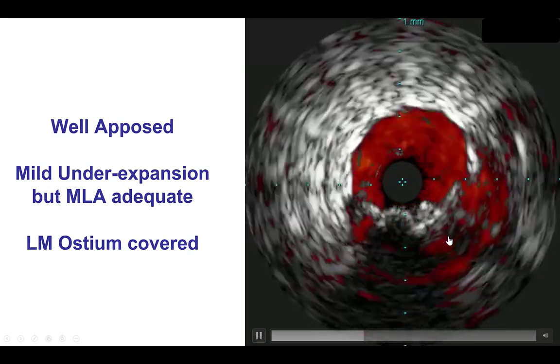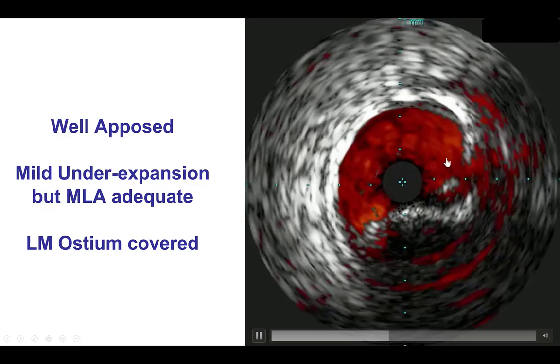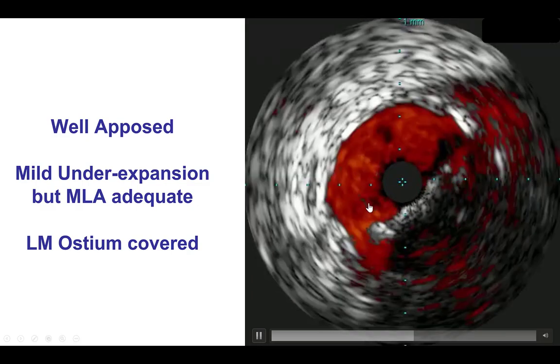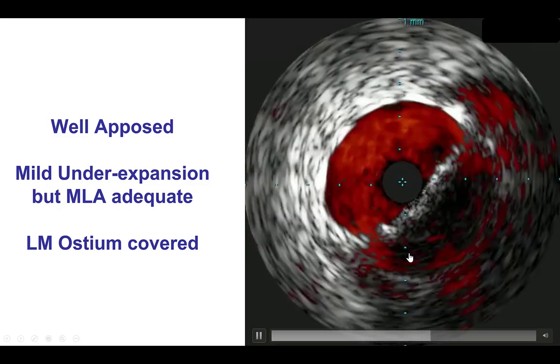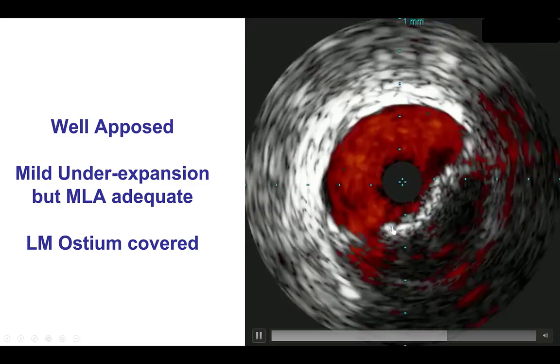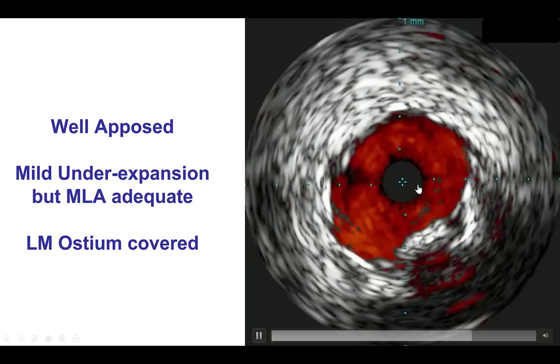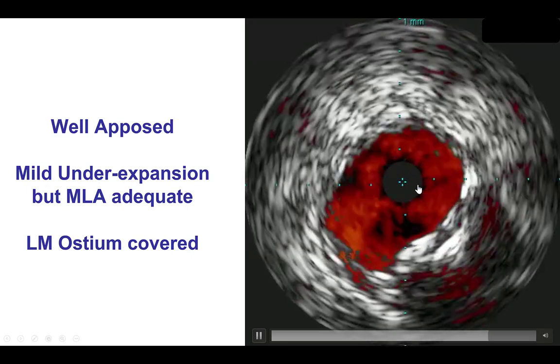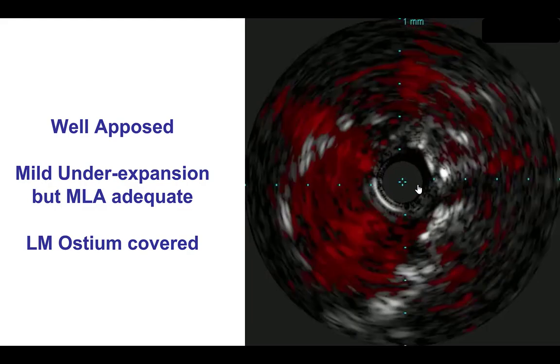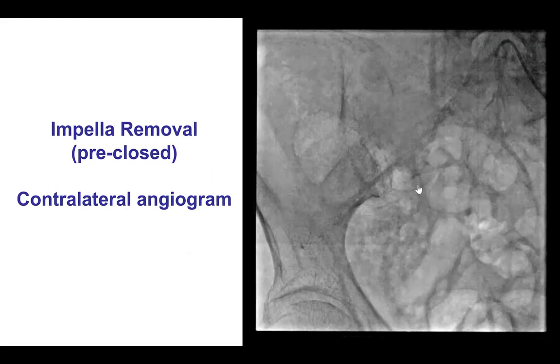Potentially we could have gone at even higher pressures to try to expand it even more, but the area was adequate and the ostium was well covered as well, even though the shape of the vessel was more oval. We did have adequate coverage of the ostium.